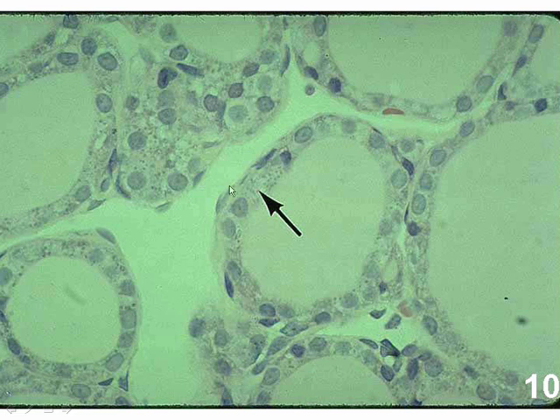Just at the base of the epithelium, you can see endothelial cells of the vasculature. This is a highly vascular organ, as are all endocrine organs, because these organs are secreting hormones into the blood, and you have a very close association of the secretory cells with the vascular system.